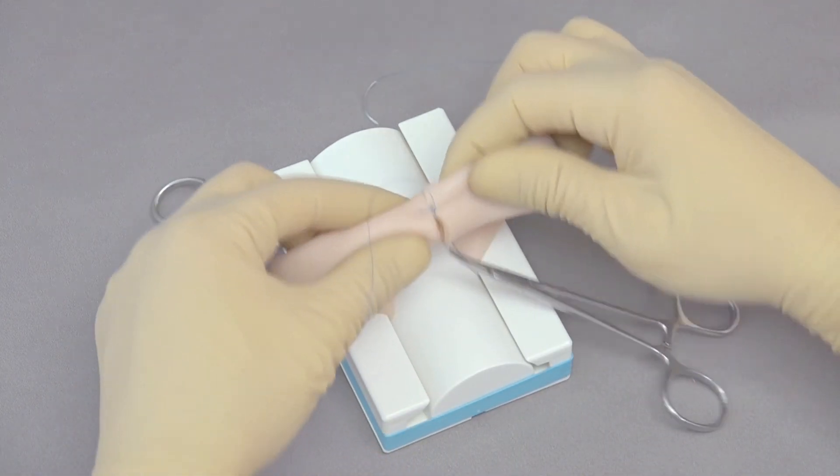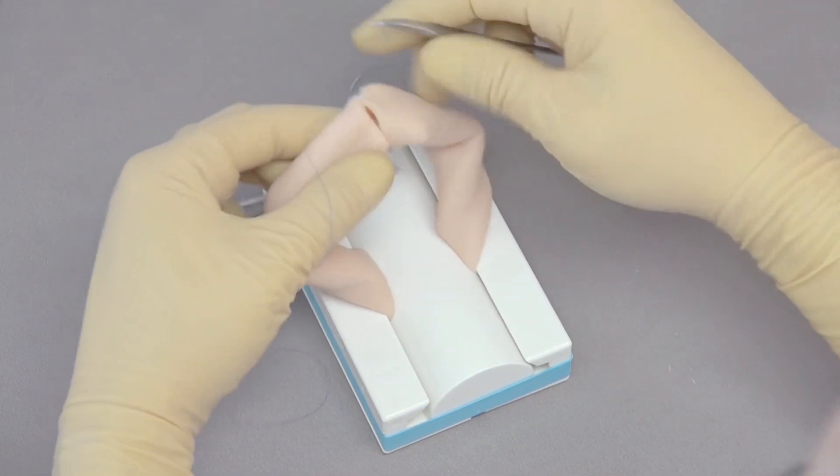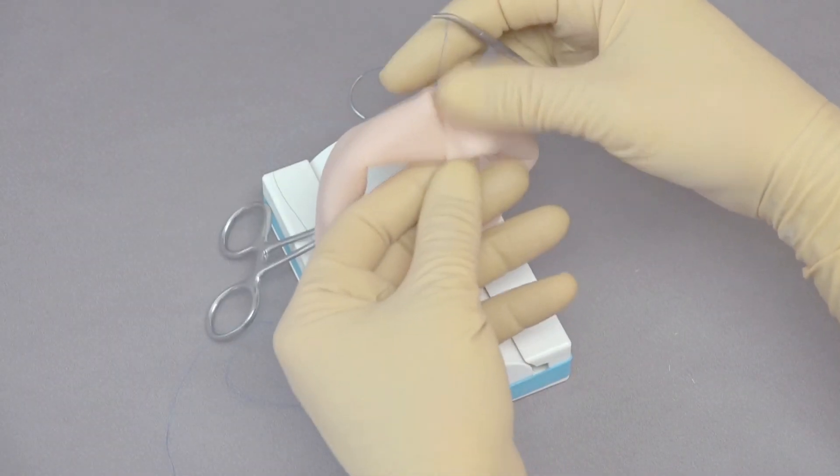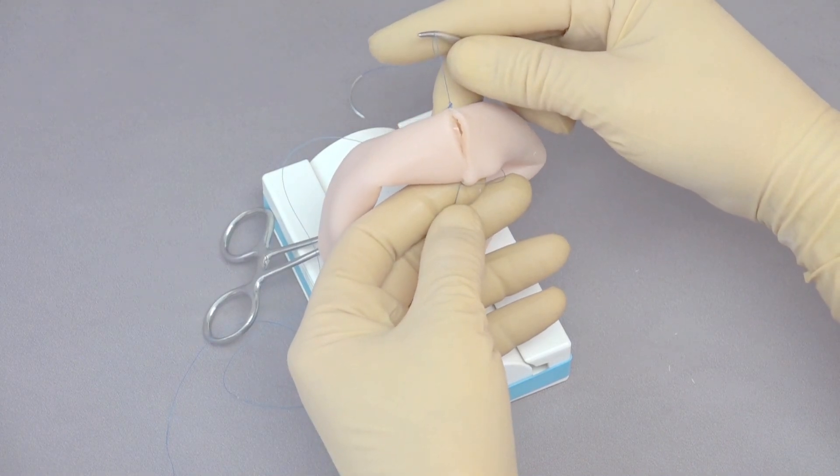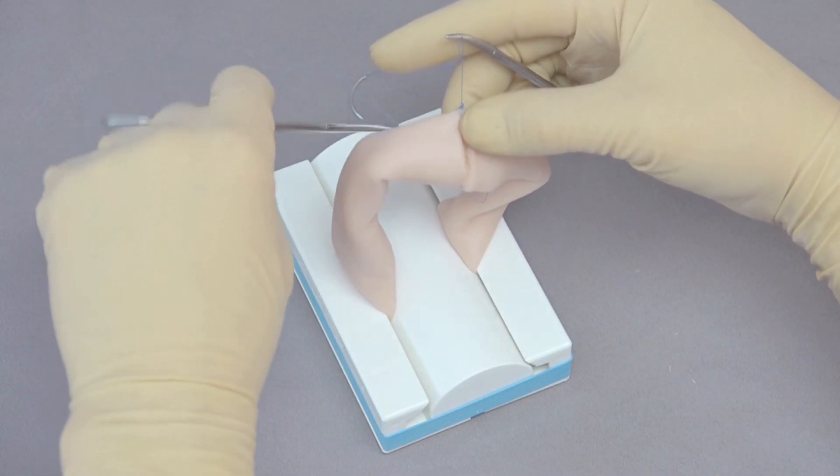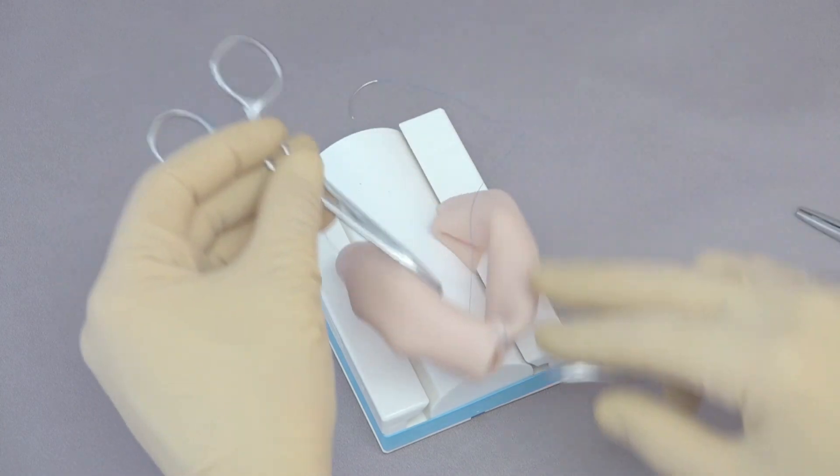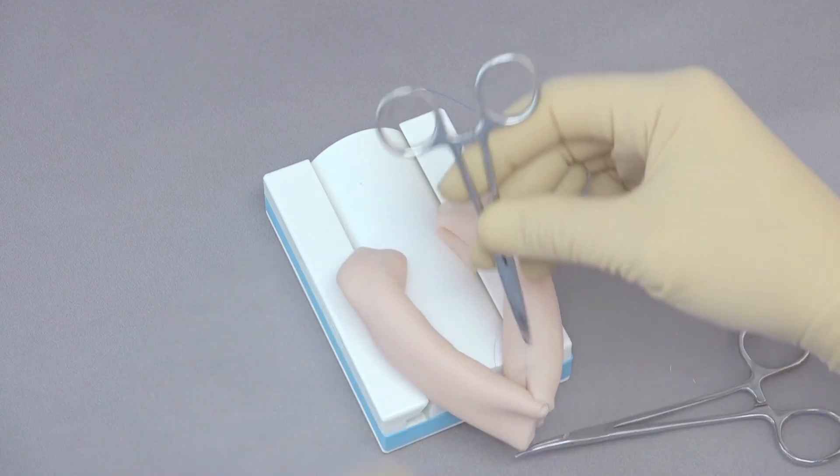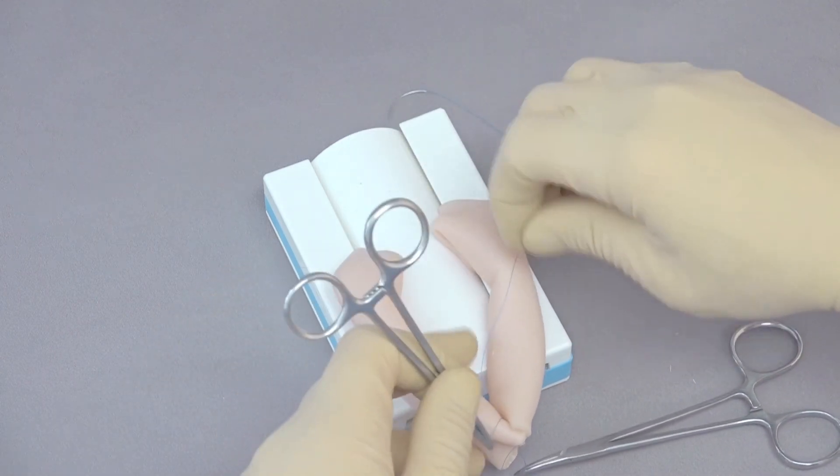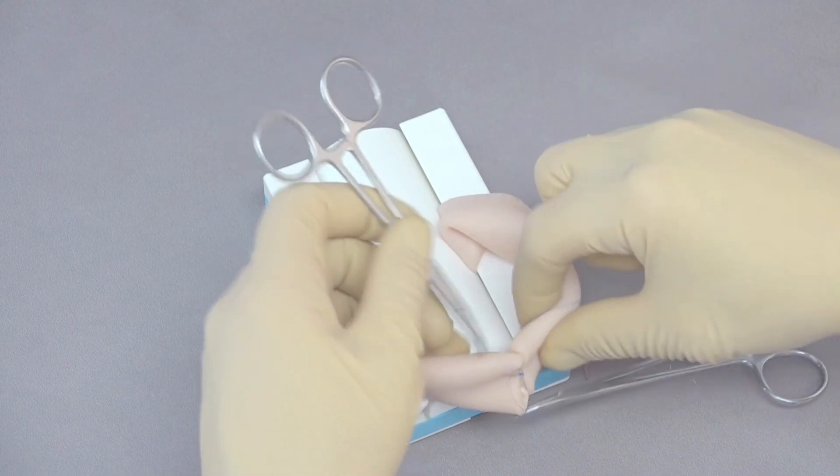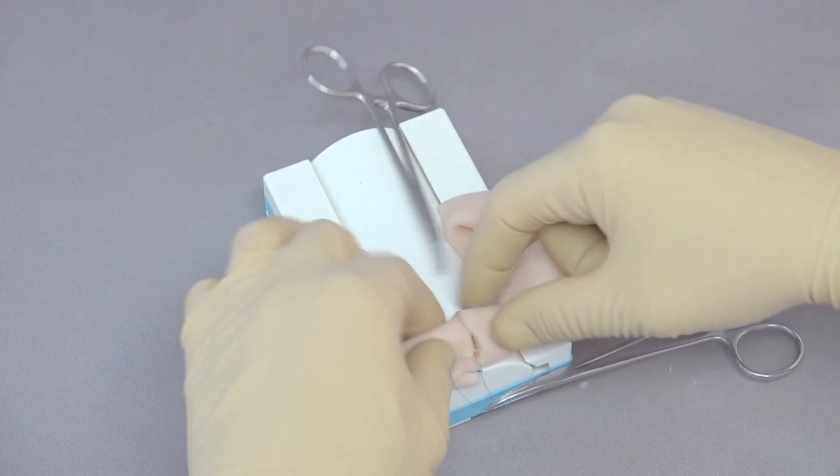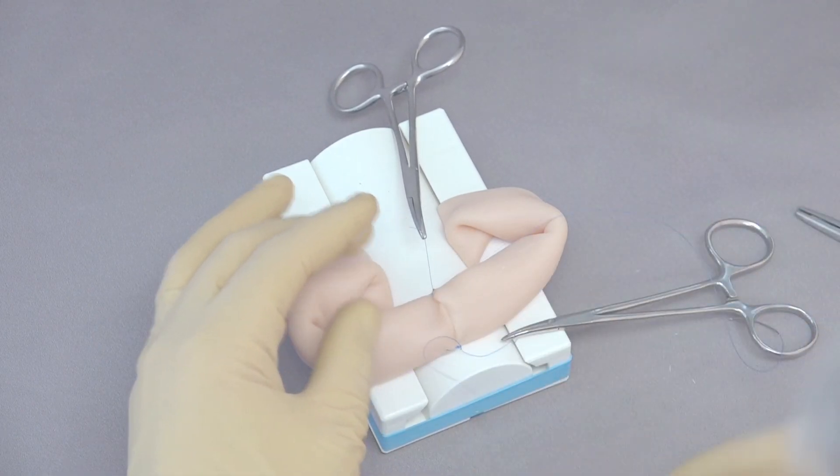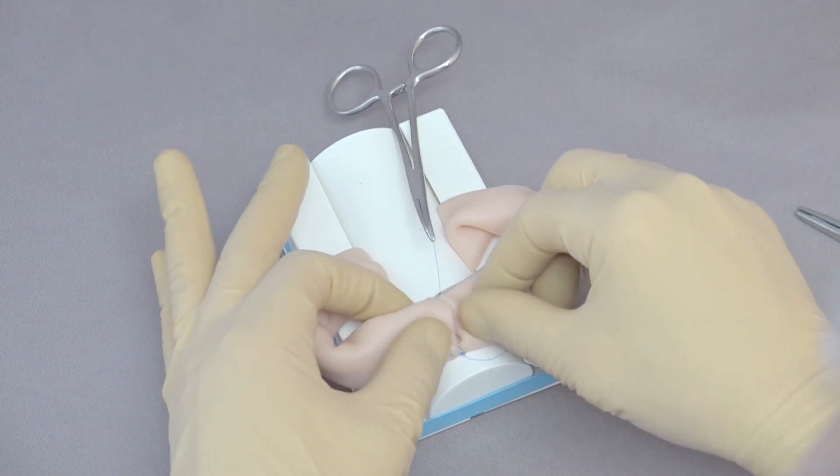So in essence what I've done is I have a suture here on what I'm considering my anti-mesenteric surface, and a suture here which is on the mesenteric surface. I want to close this with the most superficial part up. So I can come back to my first line, this was the first one that I made here on the anti-mesenteric surface. I can flatten this out now and close this side of the intestine. That's going to work the easiest in this case.